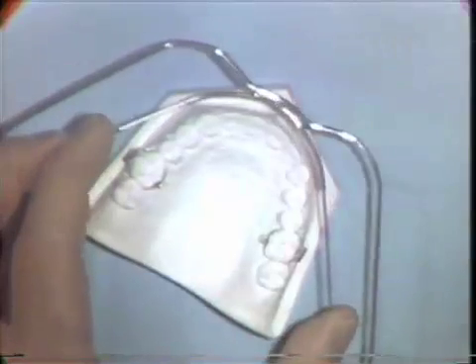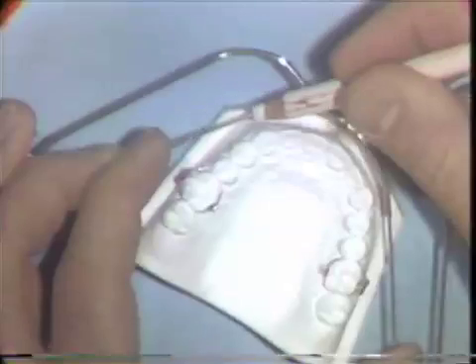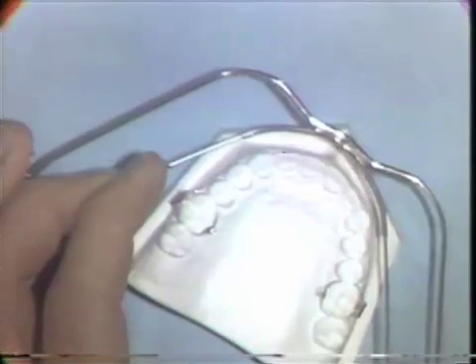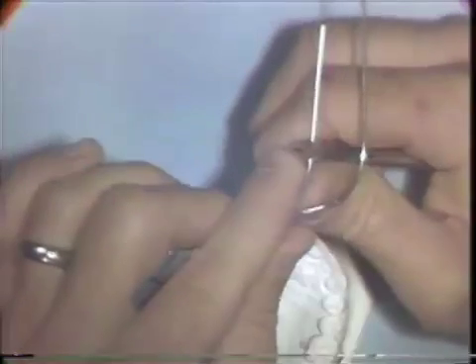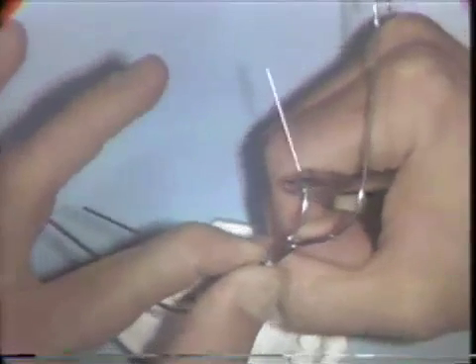A second bend is now needed at the cuspid region to swing it distally. You mark the wire where you want the bend to be placed and make the necessary bend. Place the Facebow wire deep in the plier beaks and bend the solder joint side of the Facebow in order to make a bend in this thick portion of the inner bow.